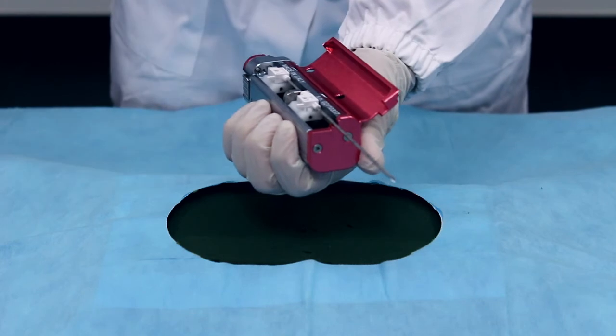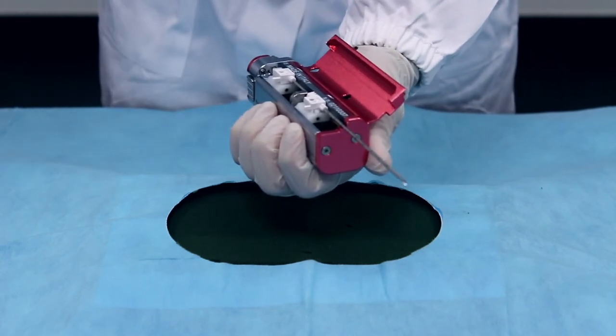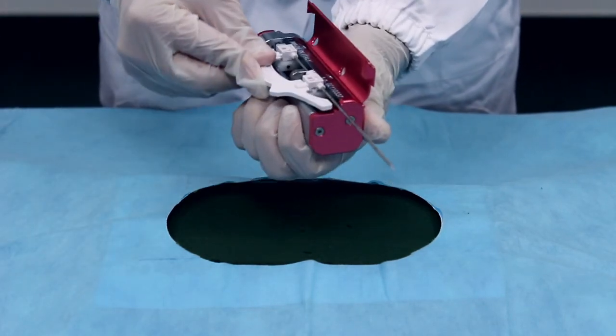Once all biopsies have been performed, remove the needle using the spacer to extract it from the Palium gun.